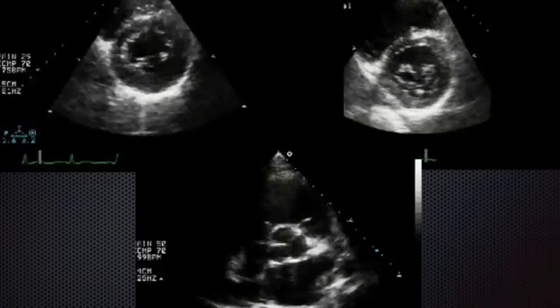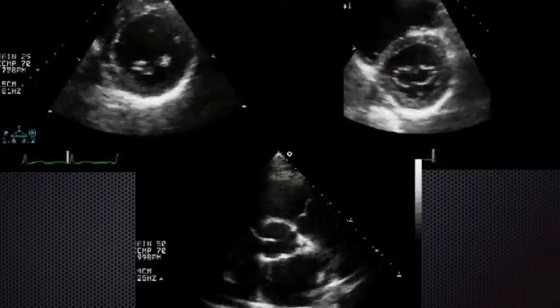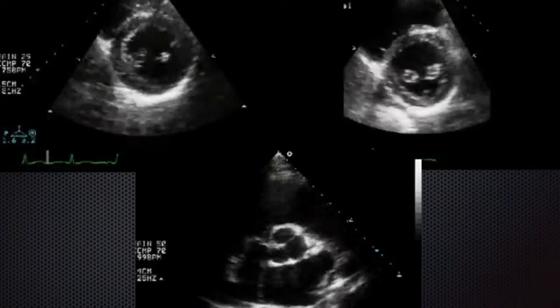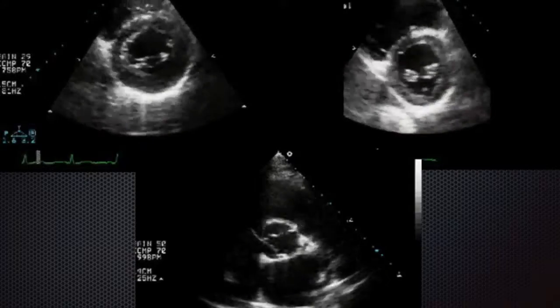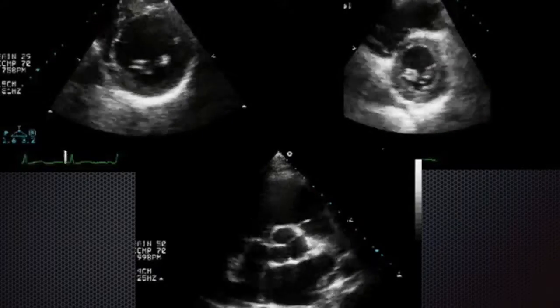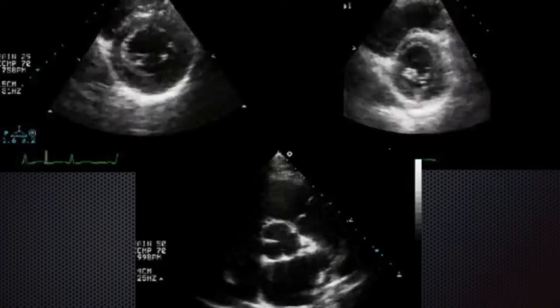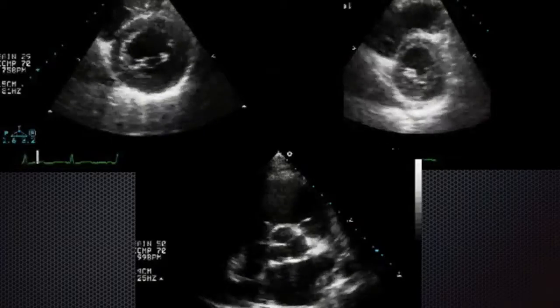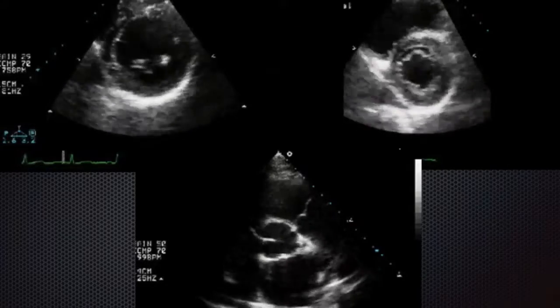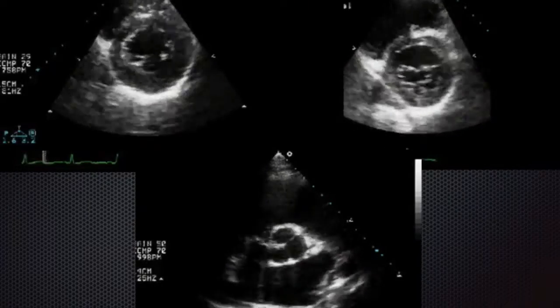for that particular area. Now, as we go to the top of the right of the screen, we're taking the slice now through the mitral valve. So the mitral valve is in the middle of the screen with the anterior leaflet at the top and the posterior leaflet at the bottom. And you see that's contracting, and the walls are still the same as what we said before. So it's another sort of cross-section of the left ventricle wall with the anterior septal area at the top and the posterior inferior segments at the bottom.